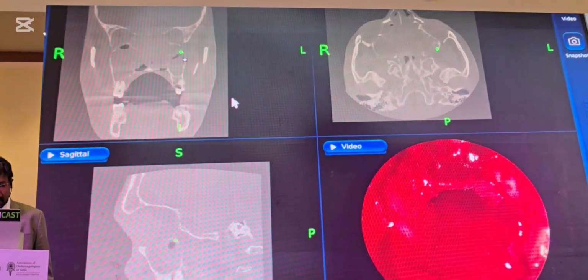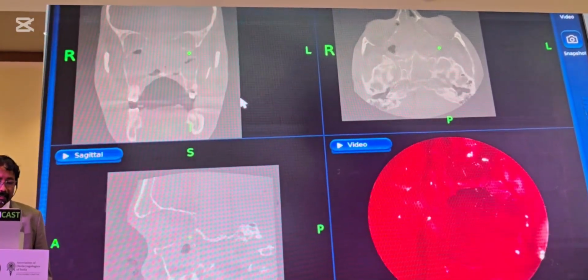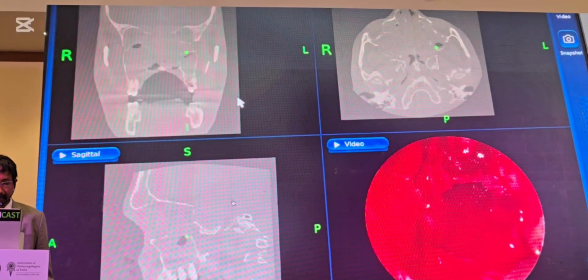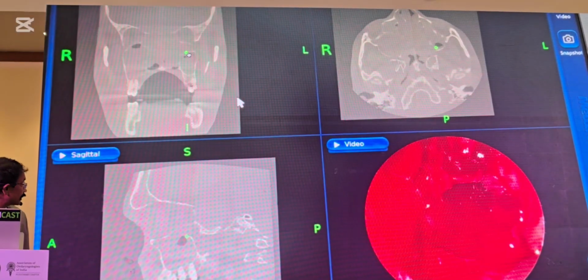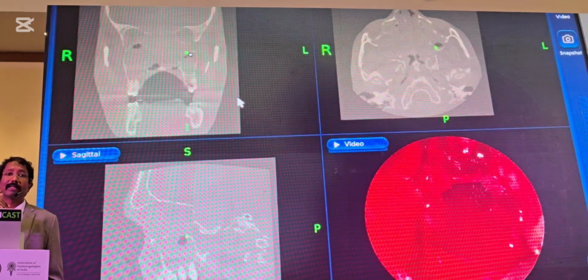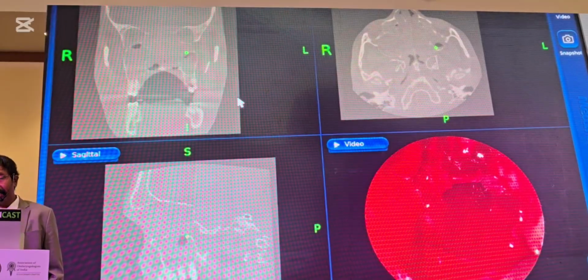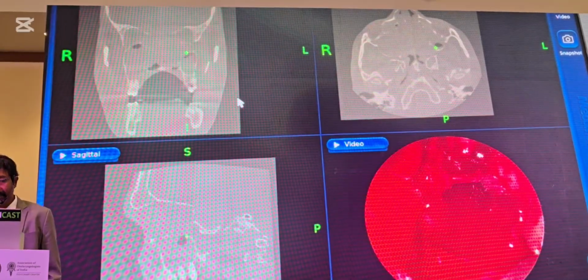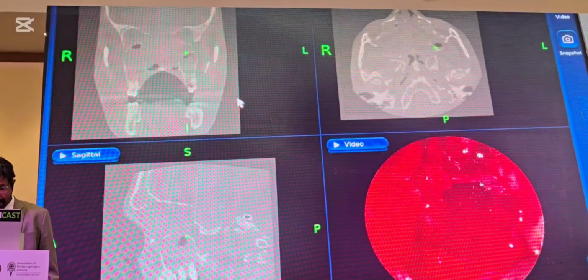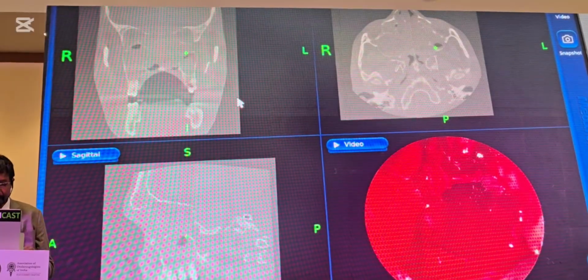So that's the lateralmost part of the maxillary sinus. There was actually an intermaxillary septum. I don't know whether you can appreciate that in this coronal view. Actually, this is one septum which is dividing the maxillary sinus as if it was looking like a Haller cell. We thought actually we entered into the orbit, that kind of situation. So this is actually with 70 degree. I'm seeing the maxillary sinus.